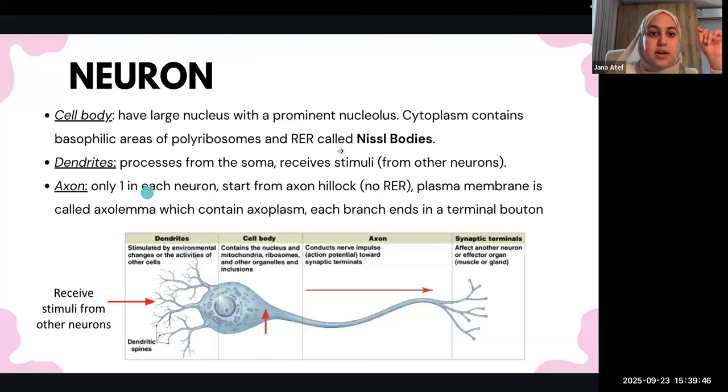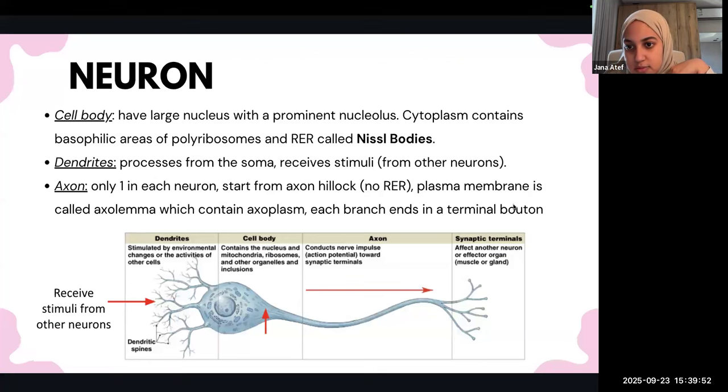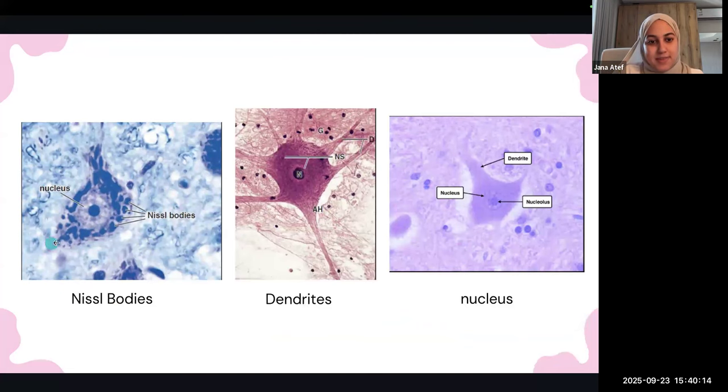Okay, now, yeah, this is from the Nissl body, specific to certain kinds of neurons? They aren't very obvious in the pictures, honestly, but no, they should be found in all kinds of neurons. This is basically the basic structure of a neuron, so everything mentioned here is found in all neurons. But some of them, yeah, you're right, aren't visible because they need a special stain. It doesn't show in all stains. See this one, how it's blue? I forgot the name of the stain, but it's clear only in certain stains.